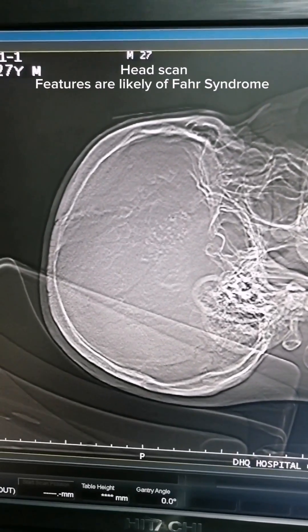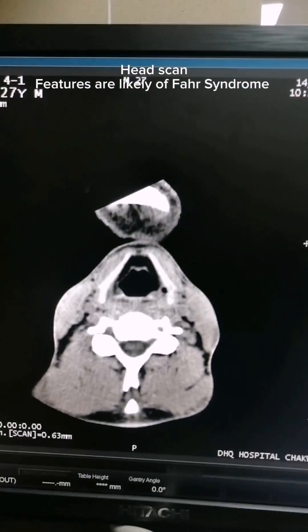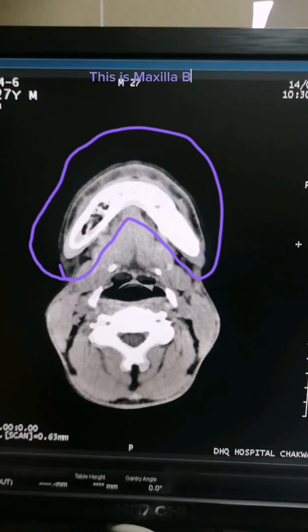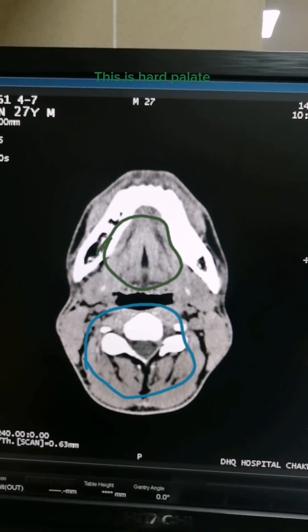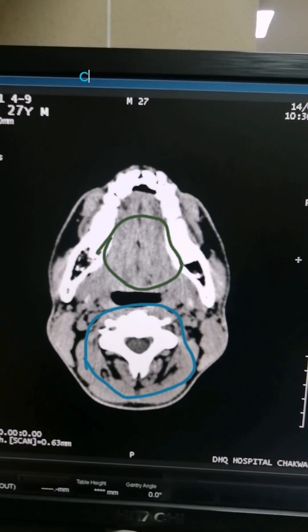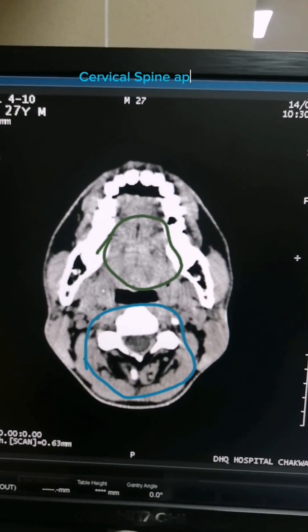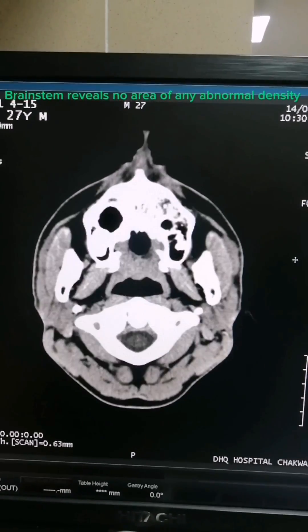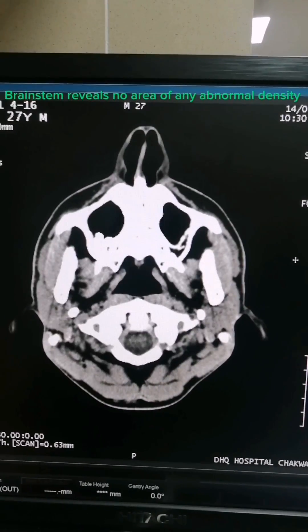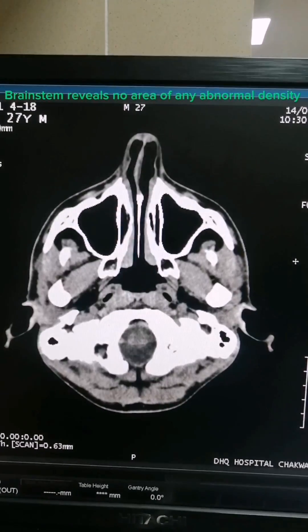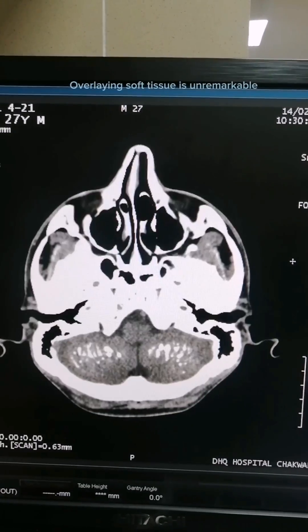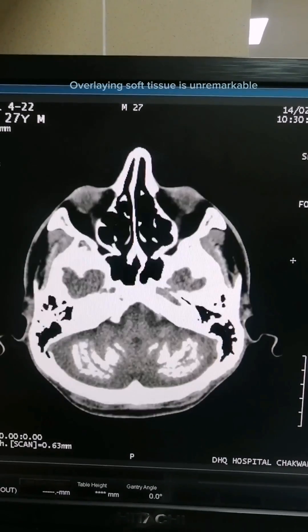Head scan features are likely of Fahr syndrome. This is the maxilla bone. This is the hard palate. The cervical spine appears. The brainstem reveals no area of any abnormal density. Overlying soft tissue is unremarkable.